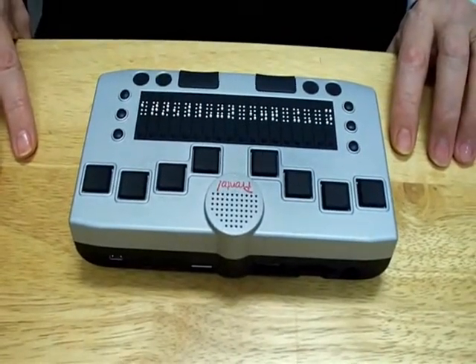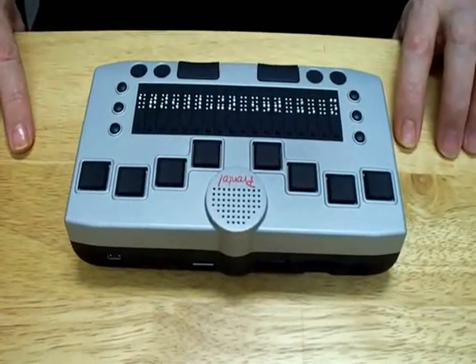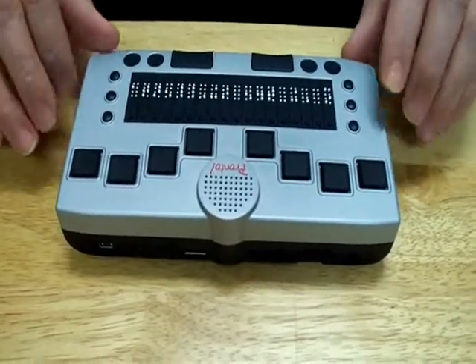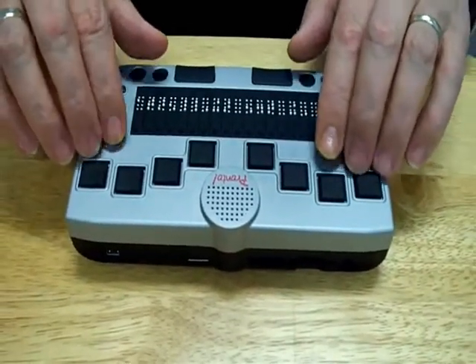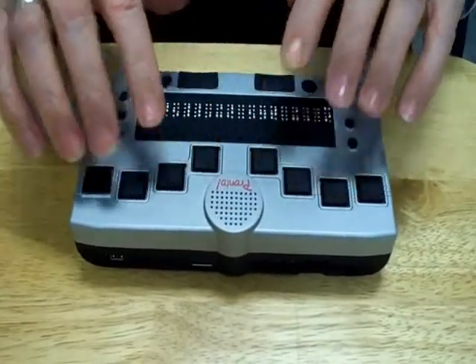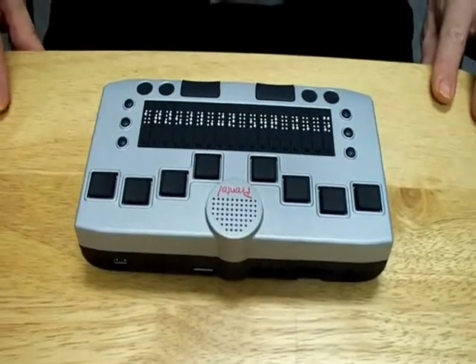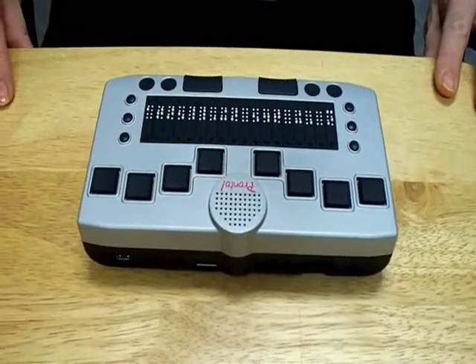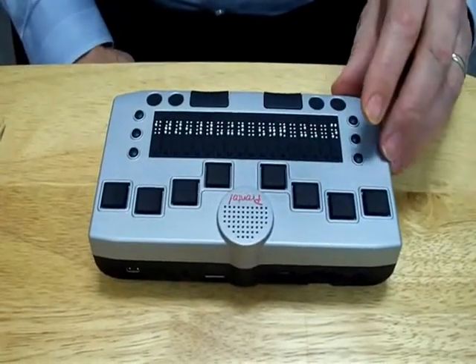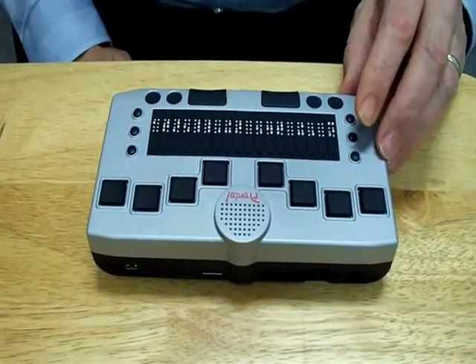Giving these various sets of keys specific names is going to make it much easier for you to use and understand the unit down the road. Going a little bit back and toward the center of the unit, there are 8 keys, 4 on the left, 4 on the right. These are called the B keys, and they're Braille keys. So on the left you've got dots 1, 2, 3, and then dot 7, and on the right you have 4, 5, 6, and dot 8.